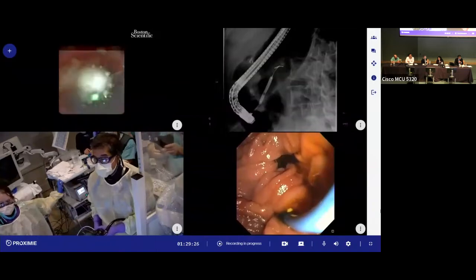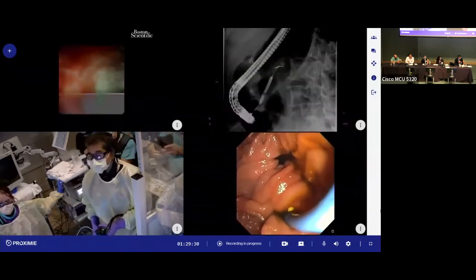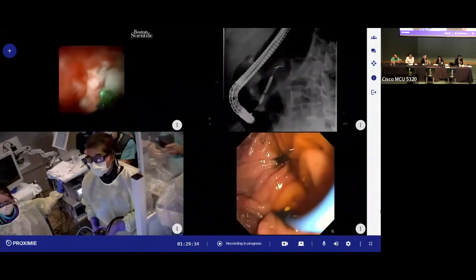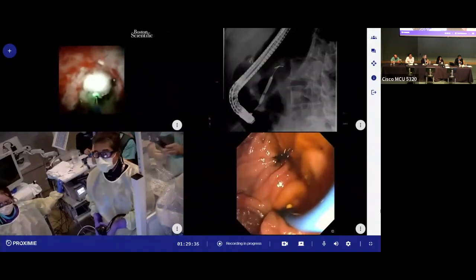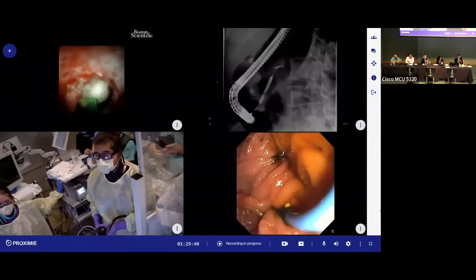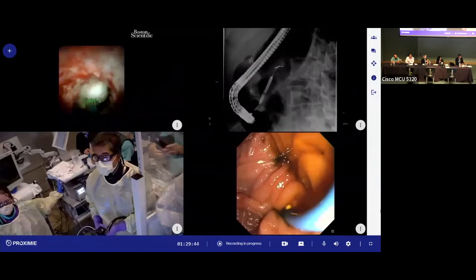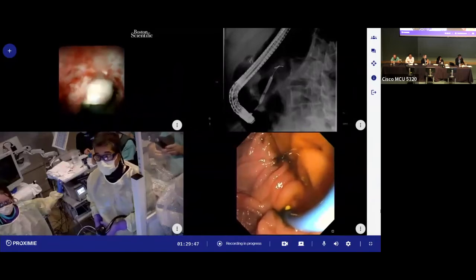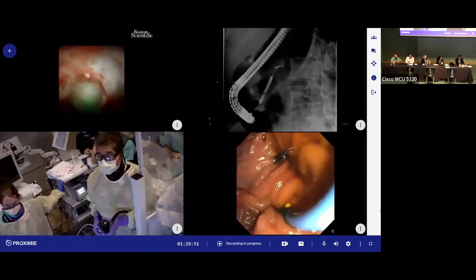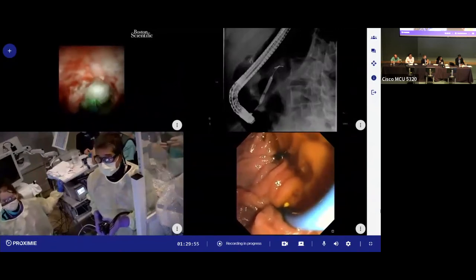It's very precise, so that can be an advantage and a disadvantage. The advantage of the precision is that it can be faster if you have good position. Where EHL can be more favorable is that if you have the EHL fiber off to the side, you can still cause fracturing of a stone. But for pancreatic duct stones, which are mostly calcium, we have come to prefer laser.